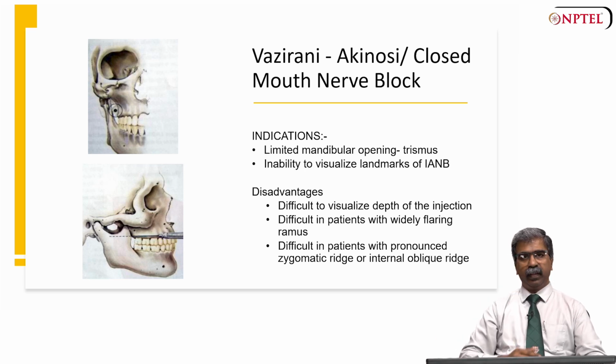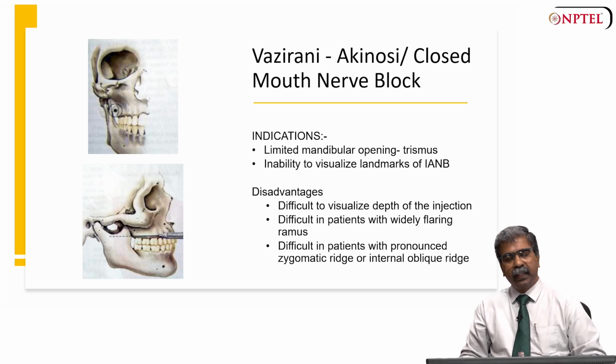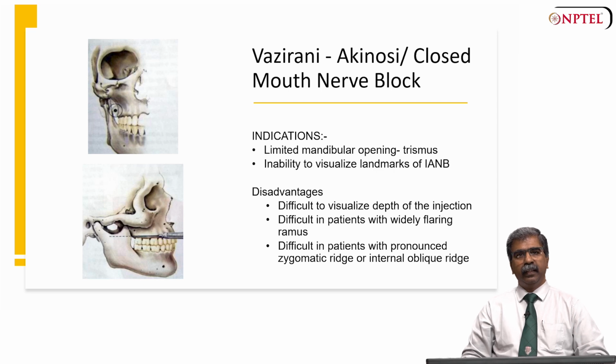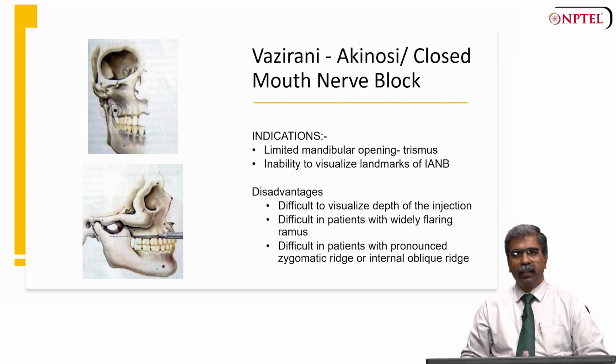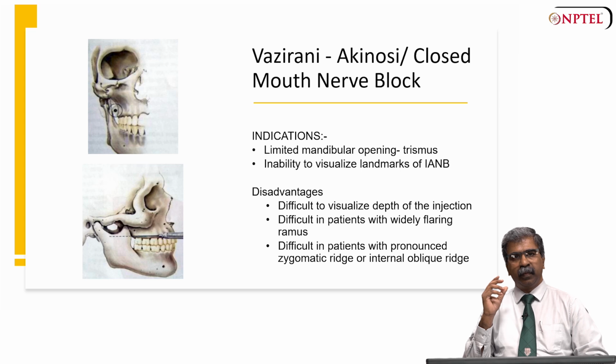So, coming to another very important, though not very often used, technique, the Vazirani-Akinosi or the closed mouth technique. The indications include where there is a limited mandibular opening or trismus.